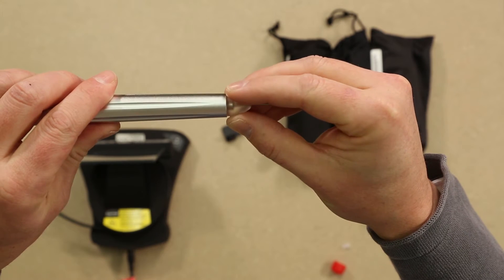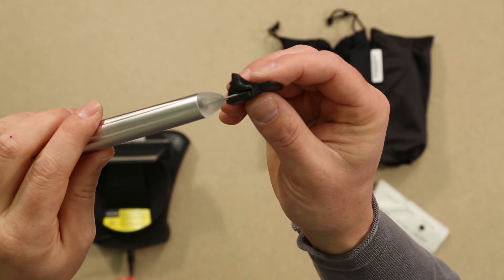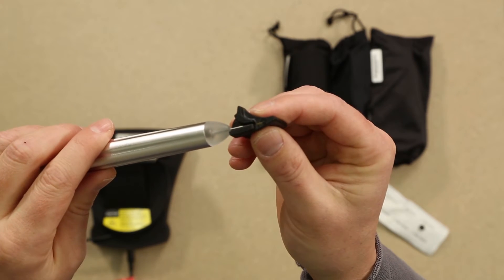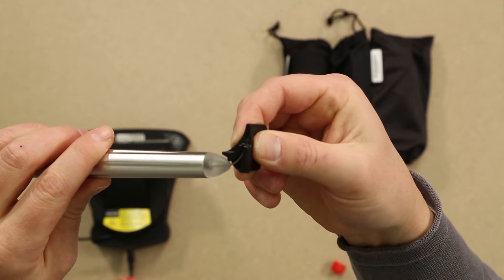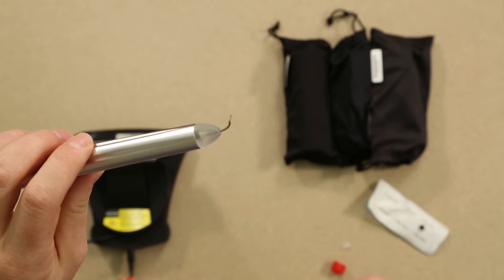Gently screw on the tip to the metal handpiece. Take the black bending tool and align with the tip. Turn the tip until it reaches approximately a 90 degree angle. You will notice that the tip is pre-initiated and ready for use.